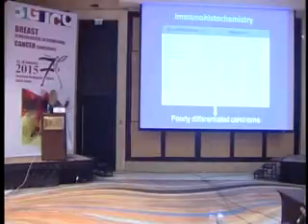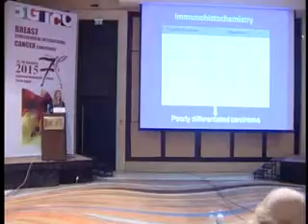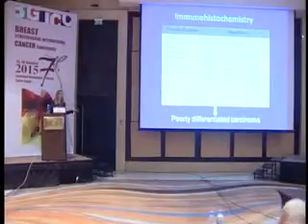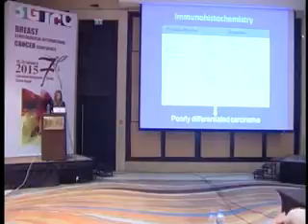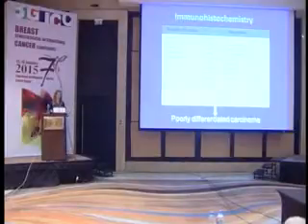And these are the negatives. The positives were some keratin, CAM 5.2, CD15 focally, which didn't tell me anything. Vimentin, if you throw it on my skin, might be positive, it doesn't tell you anything. Chromogranin, very few foci, chromogranin and synaptophysin. So I was puzzled. I said, you know what, I'll give up. I'm calling it poorly differentiated carcinoma, and start digging in the literature.